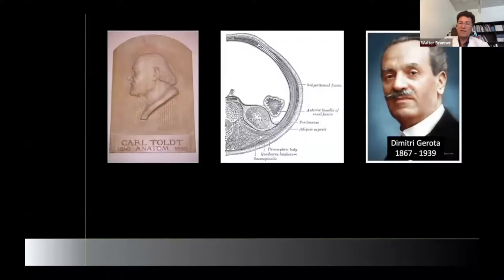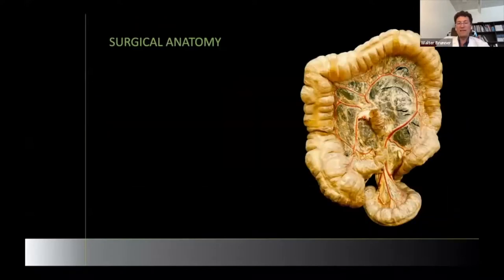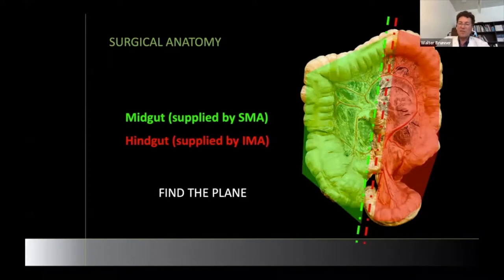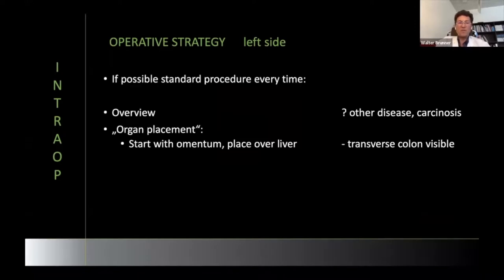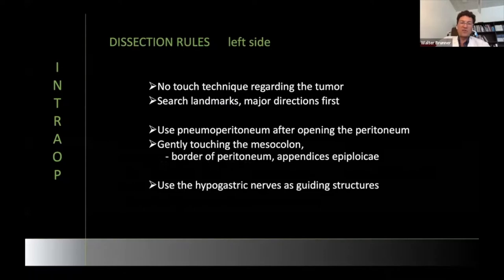You can also grab the artery, which works pretty well, but not the vein — if you touch the vein too much it will rupture. To avoid breaking into the mesocolon, always use a swab. Think of your instruments — if you have a very sharp instrument, you may rupture your fatty tissue even if you don't want to. Here's the example: you don't grab the colon, just use the fatty tissue beside it, then go very precisely in the perfect line using the peritoneum to open it slightly, making tension only on the fatty tissue and not on the colon itself. If you stay in the plane, it works perfectly.